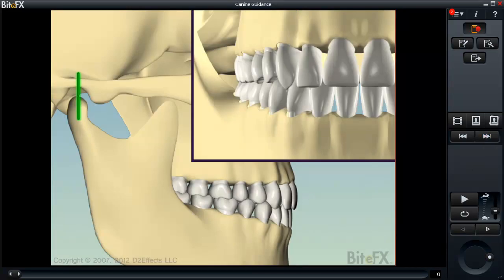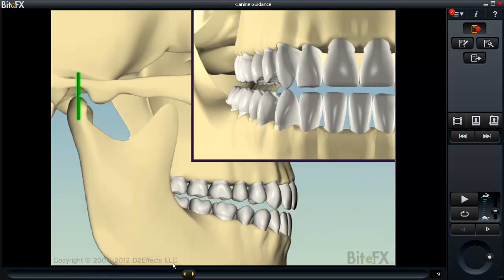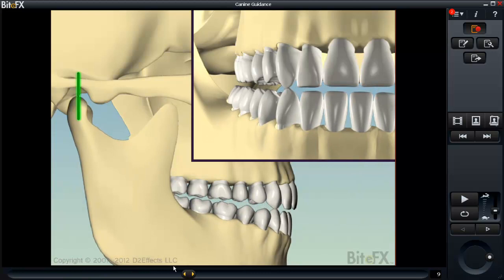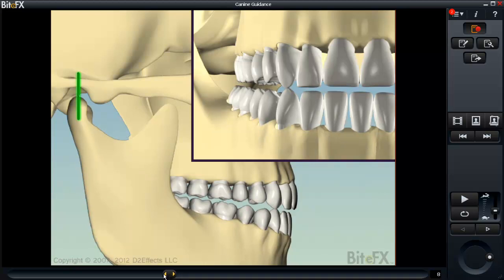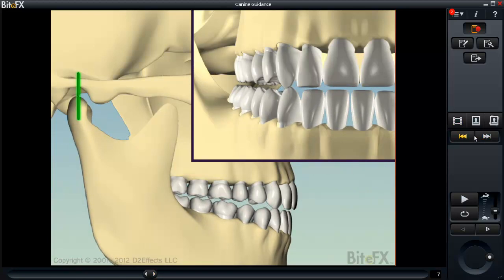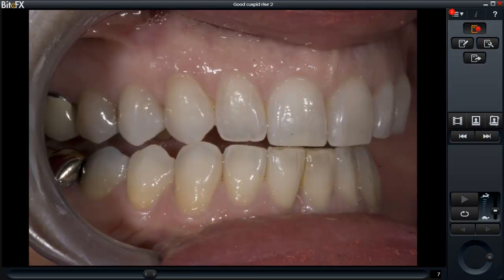Another important element in the stable bite is canine guidance. I show them that if they were to move their jaw sideways — either when they're awake or when they're asleep — the only teeth they should touch would be the canines, and all the back teeth would come apart simultaneously with no contact on any back teeth. I show them what this looks like clinically; this could be a picture of their own teeth or one of the stock photos in BiteFX.